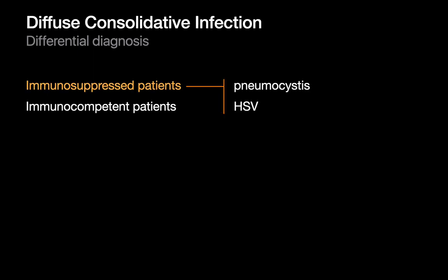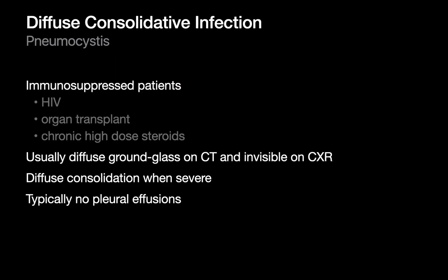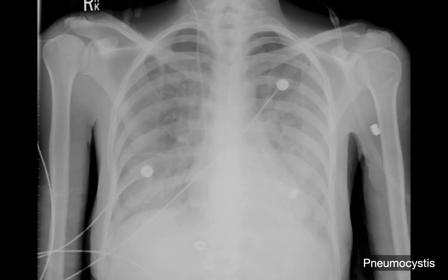In immunosuppressed patients, two infections to think about that could cause a diffuse consolidative pattern are Pneumocystis and HSV. Pneumocystis can be seen in HIV patients with low CD4 counts, but also in organ transplant recipients. Usually the presentation is diffuse ground glass on CT scan that's not perceptible on chest X-ray, but in severe cases that diffuse ground glass may progress to diffuse consolidation visible on chest X-ray and CT. Typically in these patients, no pleural effusion. Here's an example of a severe case of Pneumocystis presenting as diffuse consolidation.